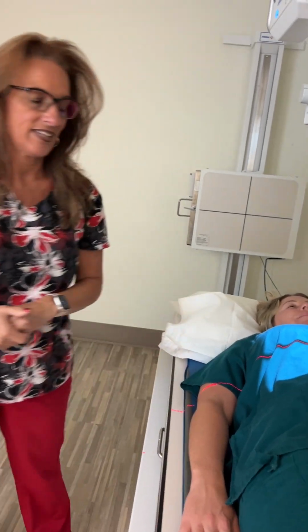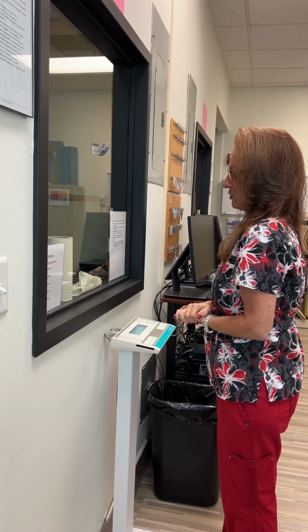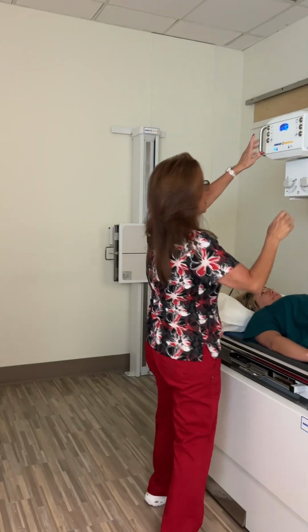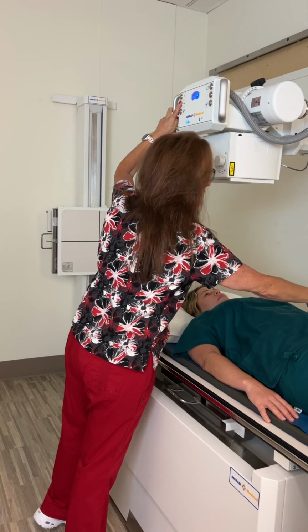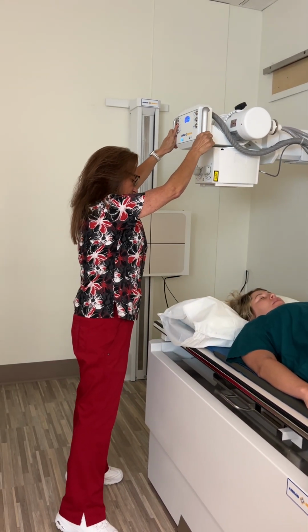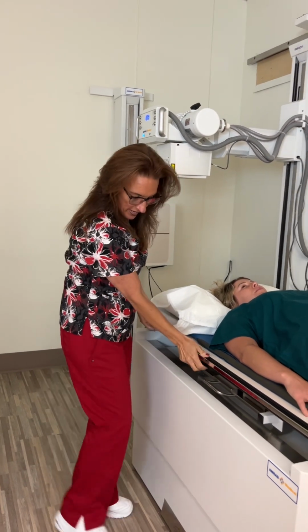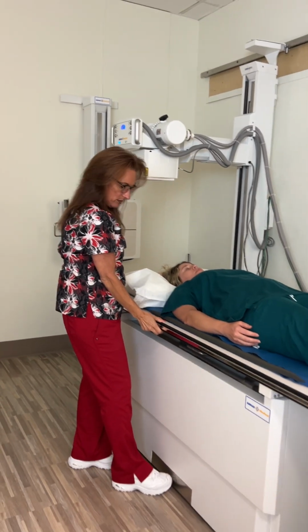Okay. All right. Take in a nice deep breath. Blow that breath all out. Hold it out. Don't breathe. Good. Beep. All right. At this point, I would go check all those images and make sure that those came out. As long as they did, I don't want to forget my marker. I'm going to move the tube completely out of the way so that the patient has no chance of striking her head or any other body part on that. I'm going to move this out a little bit.